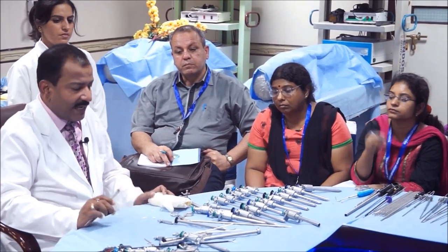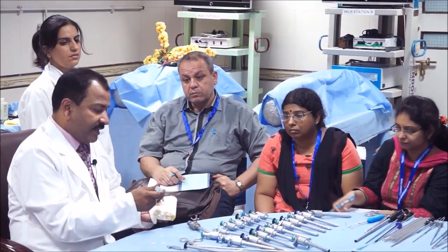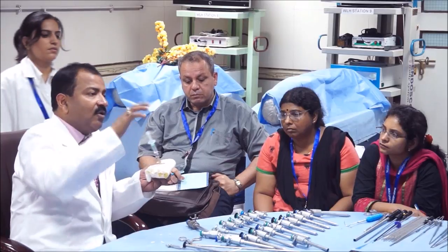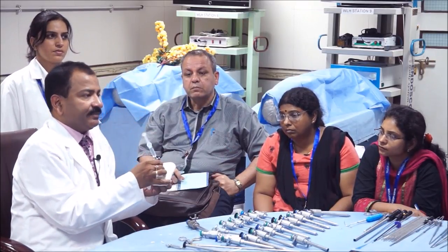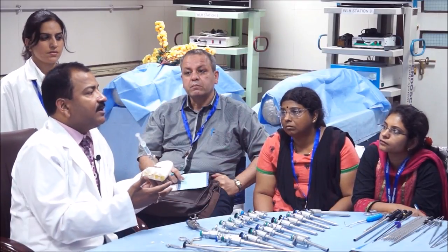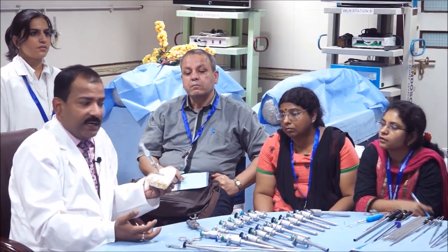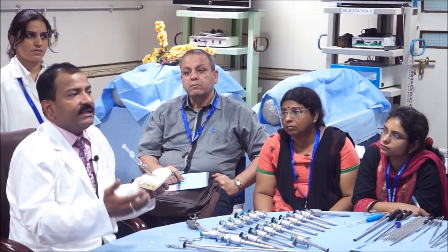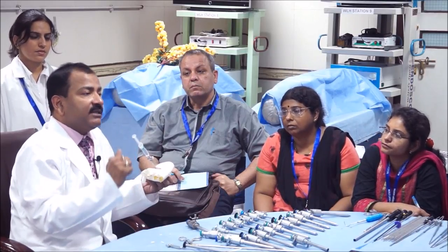Now second is, as soon as it is in, you should do the irrigation, suction and hanging drop test. This is the irrigation test. It should go free flow. Then you suck. When you suck, nothing should come. If the same fluid which you have irrigated is coming back, that means we are in a closed space, pre-peritoneum, maybe rectus, maybe subcutaneous. And if more fluid than you irrigated is coming back, that means the patient either has ascites or we are in the urinary bladder, which was distended.